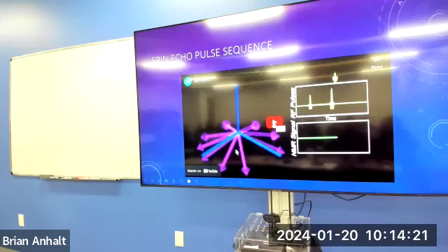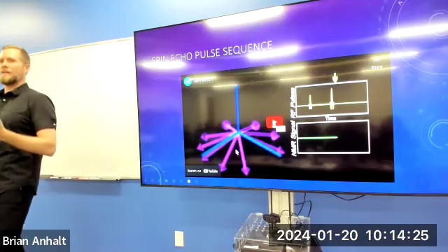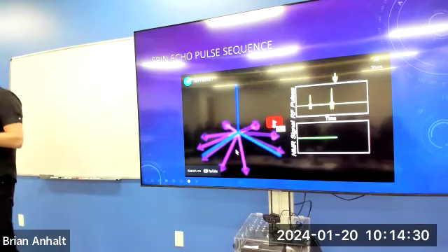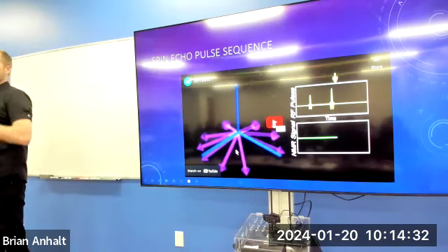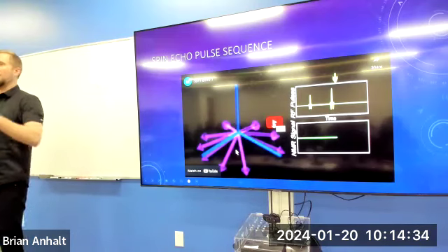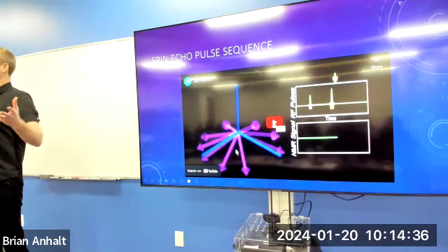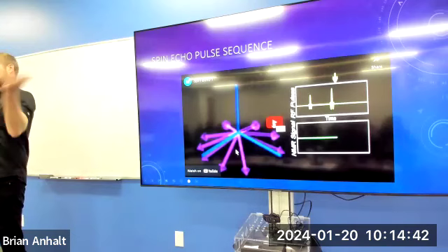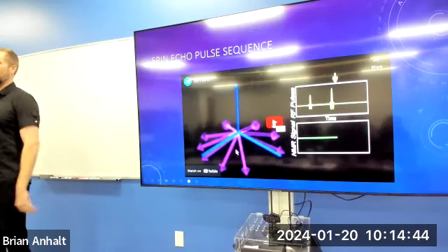And that is inhomogeneities. And remember, magnetic susceptibilities. What does magnetic susceptibility mean? Yes, it's tissue, anything in the magnet that changes the magnetic field strength, right? So susceptibilities are going to change the field strength as well. What happens to the precessional frequencies? They change, right? And everything goes out of phase.